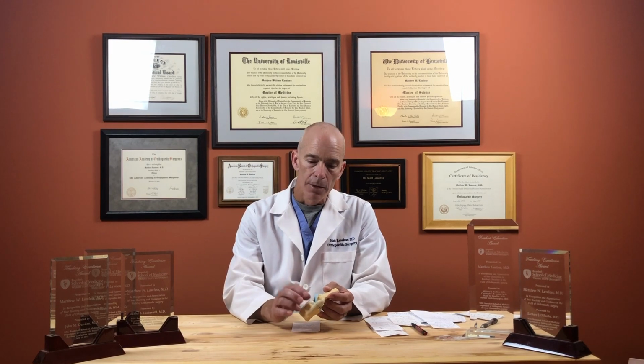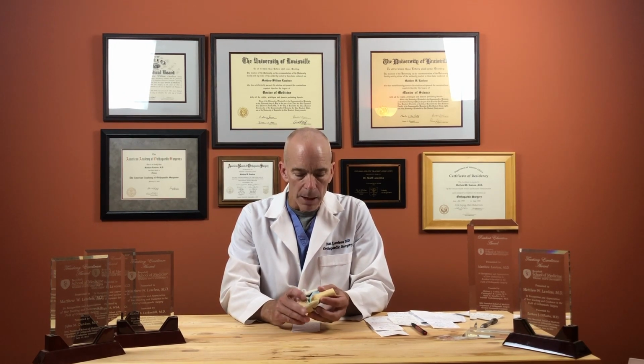In a knee replacement, we cut down through your skin, we divide your muscle, we go into your knee joint, and then we take a saw and remove about 1 centimeter of bone off the tips of your bone here. So we take about 1 centimeter of bone off your femur, your thigh bone, as well as your tibia here. We take those pieces of bone out, and then we put a metal cap on the end, put a metal cap on here, with a little plastic piece in between, and that's a knee replacement. We keep your ligaments on the side intact, we keep your tendons in the front and back intact. We just essentially resurface your knee with metal and plastic.